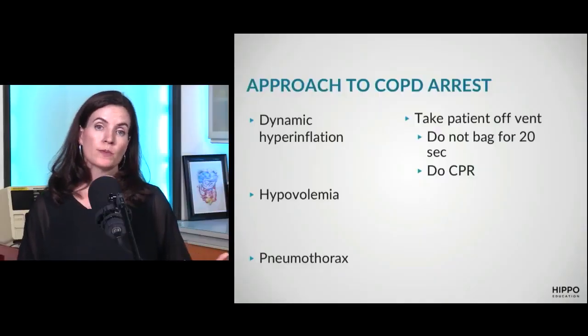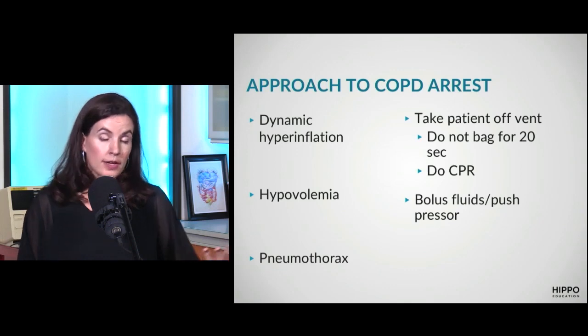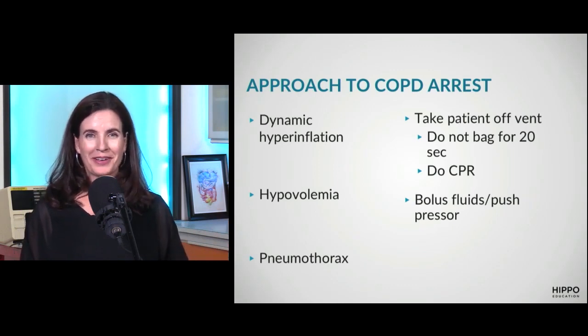Yeah, and when you do start bagging after the 20 seconds, maybe you want to be mindful to bag slow. Right, or slower than you would for your average patient, because we know they need that long expiratory phase. Okay, and so in terms of the hypovolemia, we're bolusing fluids or using a push pressor. In the arrest situation, we're giving epi typically, so that's the ultimate push pressor at high doses in cardiac arrest.